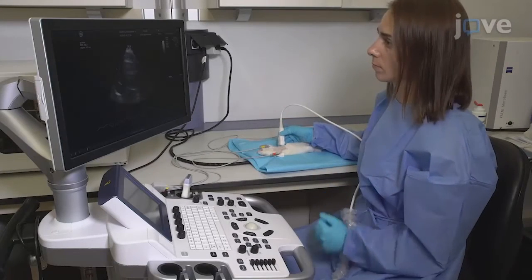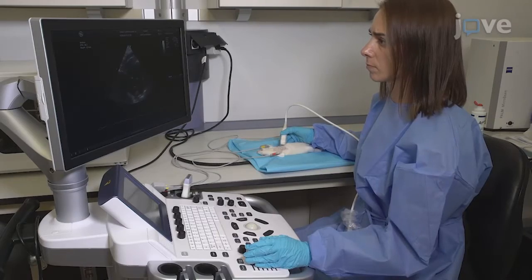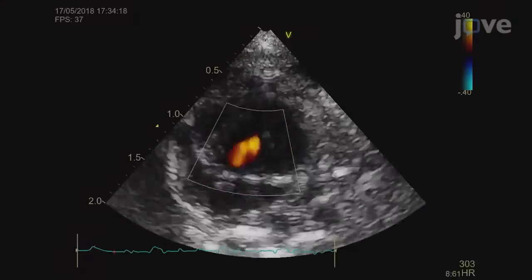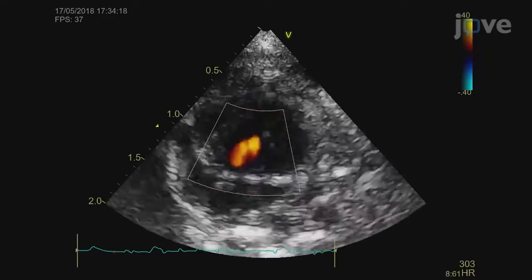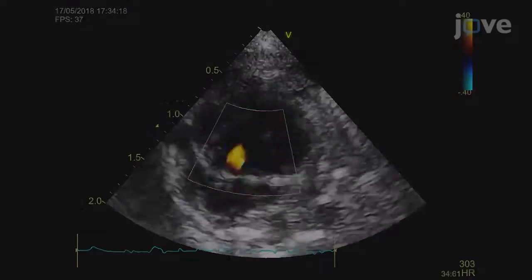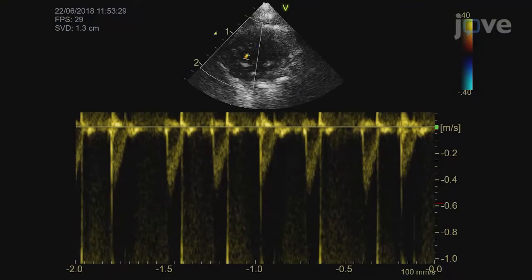To obtain an apical 5-chamber view from the 4-chamber view, tilt the probe slightly anterior to the chest. Record a 2D loop with color Doppler imaging at the aortic valve and the left ventricular outflow tract, and place the cursor parallel to the flow with the sample at the left ventricular outflow tract to obtain a spectral pulsed wave Doppler image at the left ventricular outflow tract.